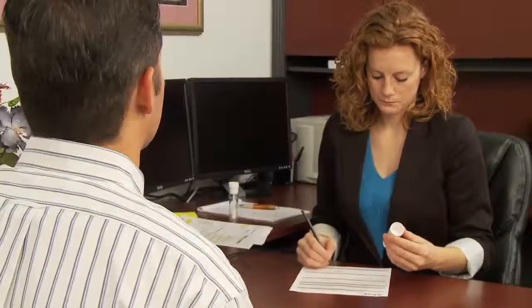If tilting and tapping enables the saliva to flow up the strip, continue to interpreting results. If tilting and tapping does not work, do not record the invalid test result. Instead, discard the test, review the collection and testing processes, and repeat the test with a new unused device.